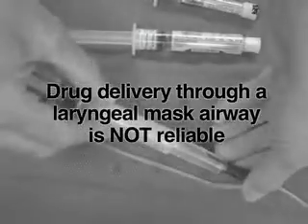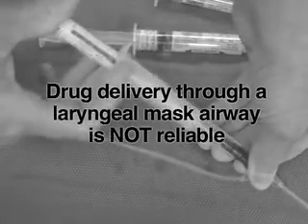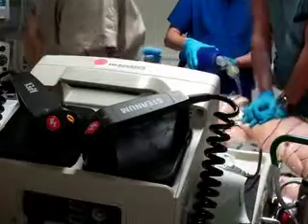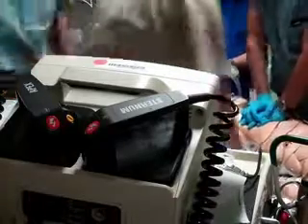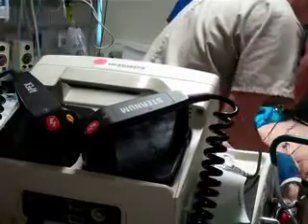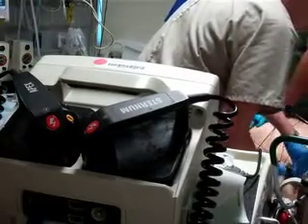Delivery of drugs through the laryngeal mask airway to the pulmonary epithelium is unreliable and is not recommended. The laryngeal mask airway may be left in place for the duration of the resuscitation. If a definitive airway is still needed, an experienced provider in airway management should replace the laryngeal mask airway with an endotracheal tube.